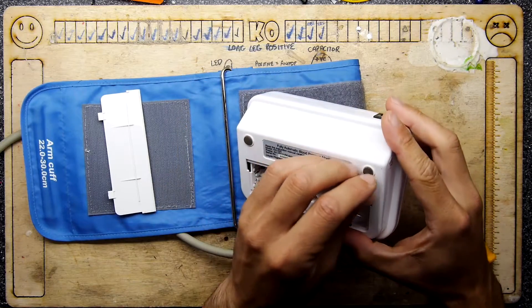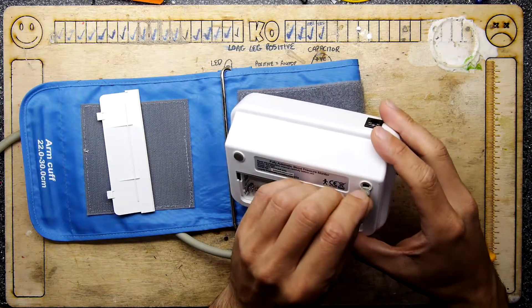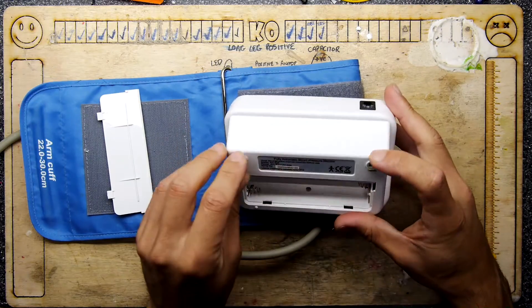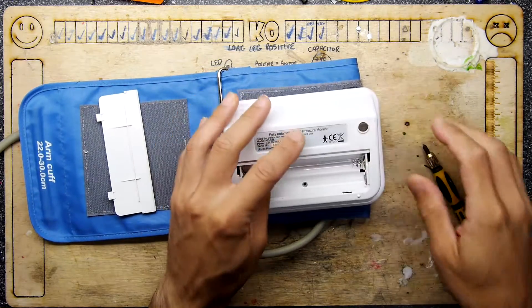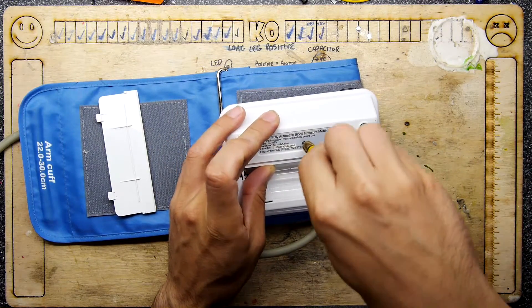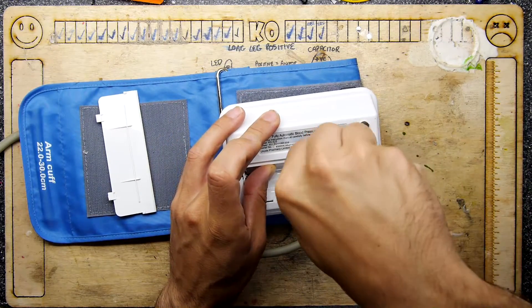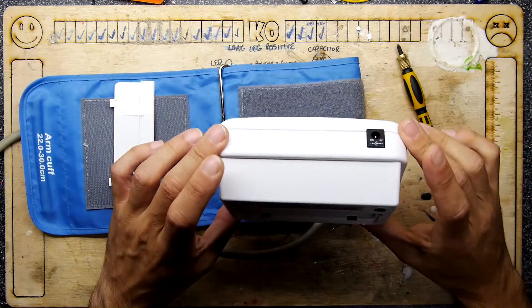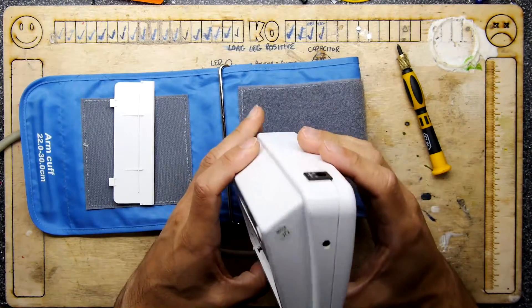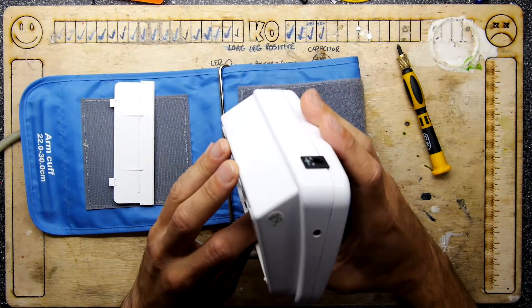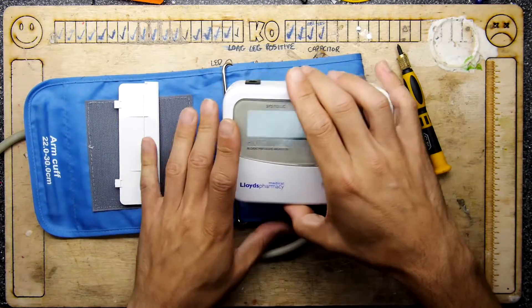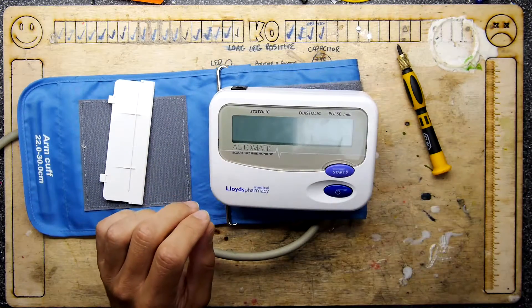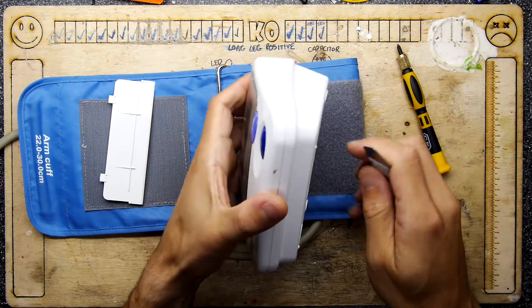But it also, I think it's a combination because if you think of how they read blood pressure normally, they kind of need sound as well. Oh hang on a minute, one screw. Intriguing. So it might have some sort of audio equipment too.